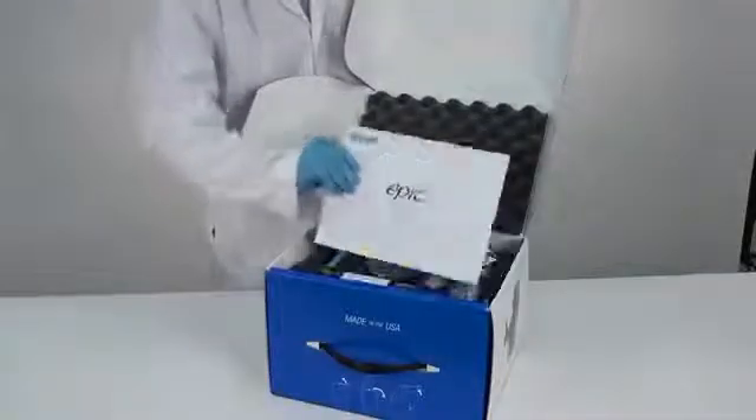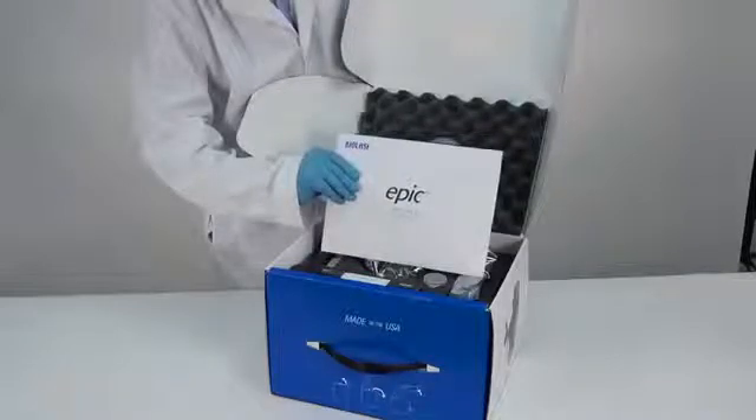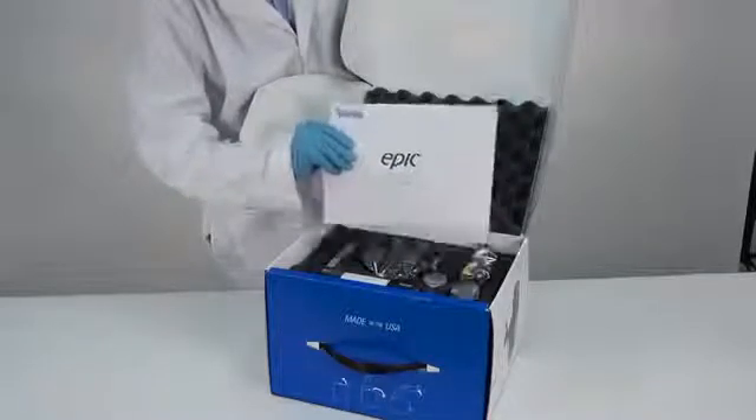You will see the EPIC Welcome Kit, which contains important documents related to your EPIC system. Be sure to review all items carefully prior to first use.